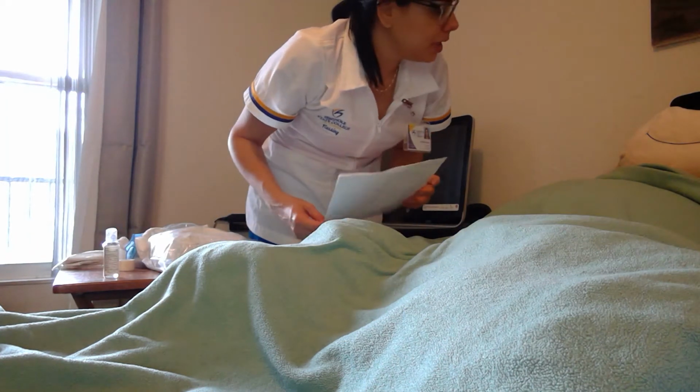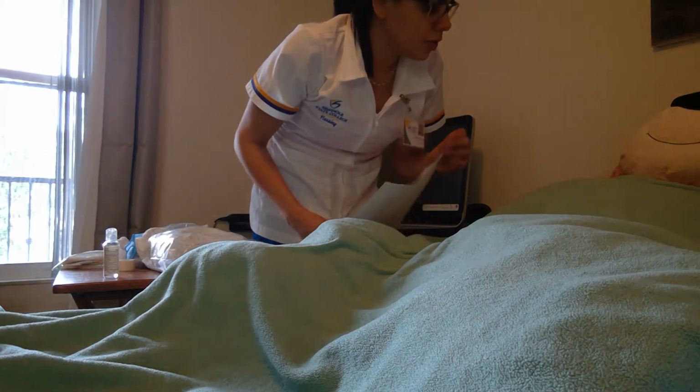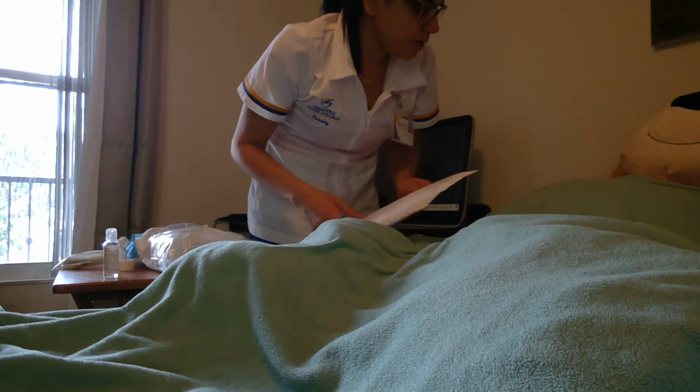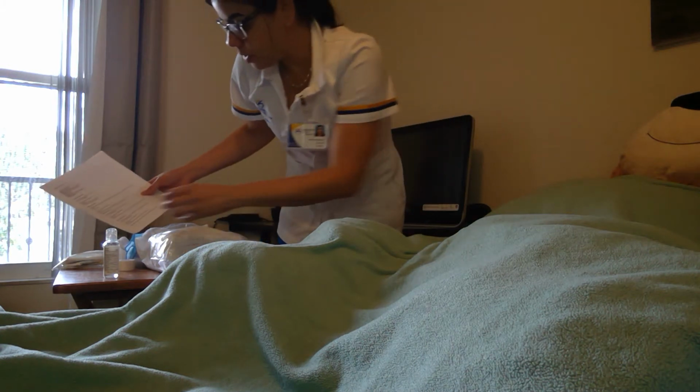Hi, Ms. Pawlowski. My name is Saida Gonzalez. I'm going to be your student nurse today, and I am here to insert your indwelling Foley catheter that your doctor has ordered for you because you have issues voiding. You have issues going to the bathroom, okay?